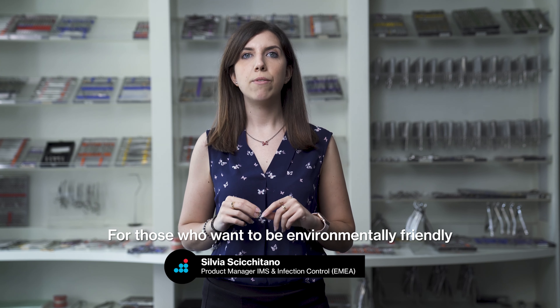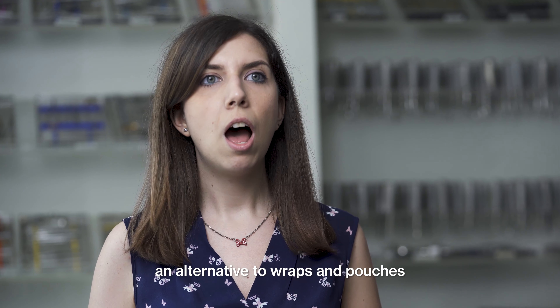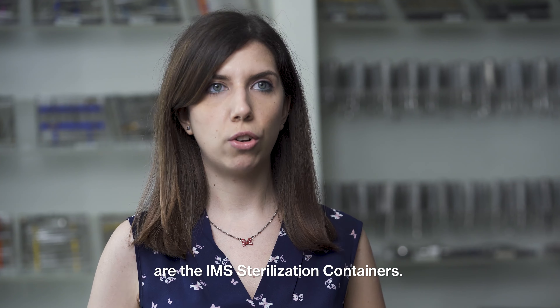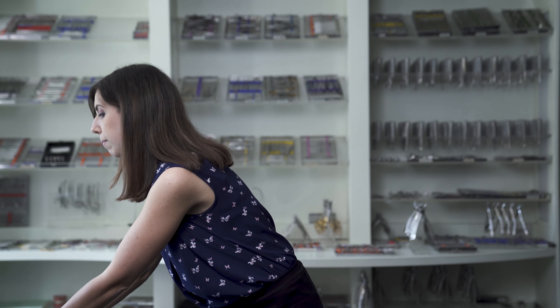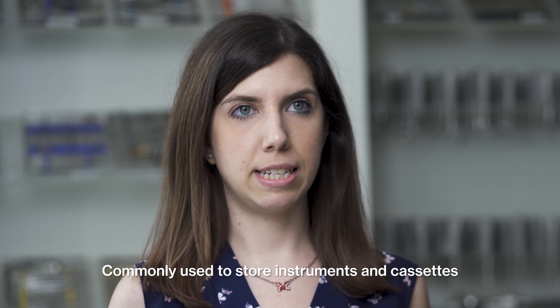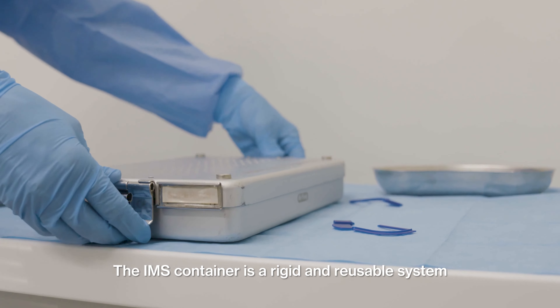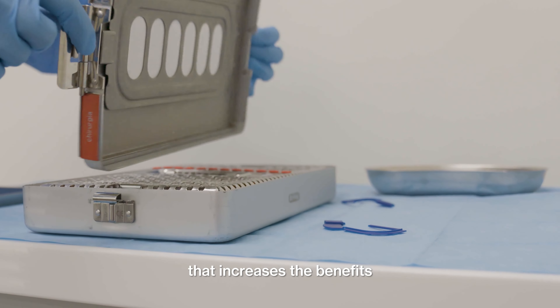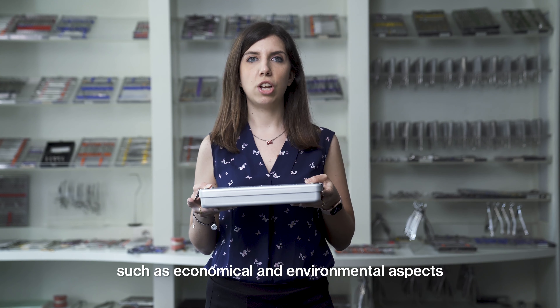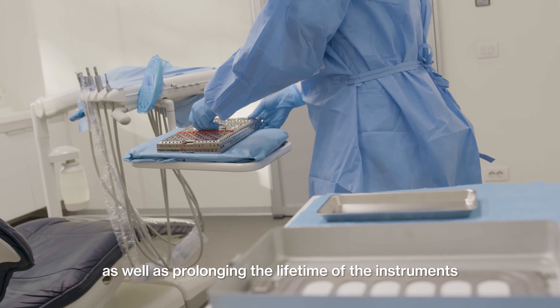For those who want to be environmentally friendly, an alternative to wraps and pouches are the IMS sterilization containers. Commonly used to store instruments and cassettes, the IMS container is a rigid and reusable system that increases the benefits such as economical and environmental aspects, increases the safety of the clinician, as well as prolonging the lifetime of the instruments.